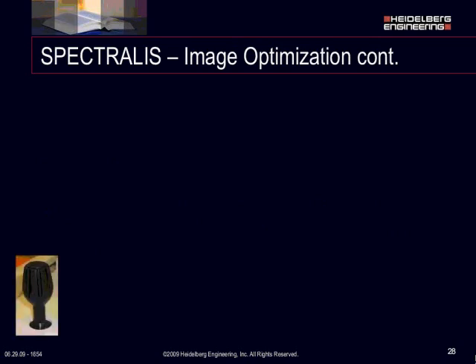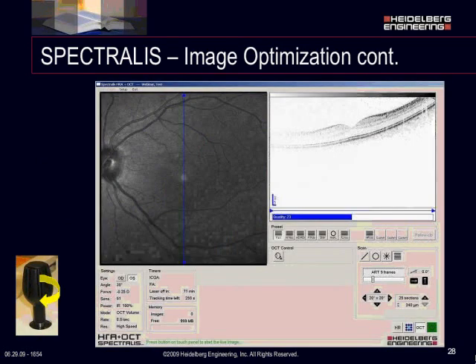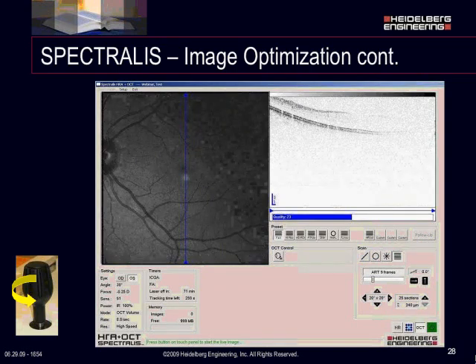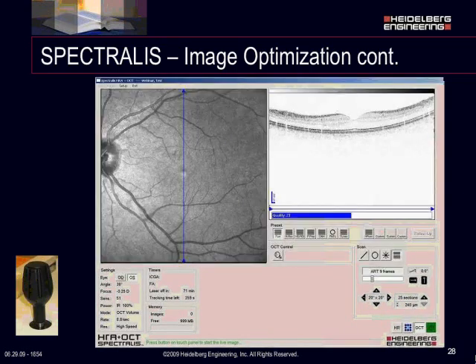Here you can see the scan goes vertically. The left side of the image is a little bit less dense than the right-hand side, so we're just going to twist that joystick. If we twist it a little bit too far, it happens the exact same on the other side. Once we find a happy medium, we can really see we have a nice fundus image, and we also have a nice, dense retinal pigment epithelium and good quality also.